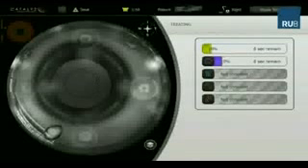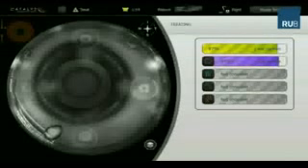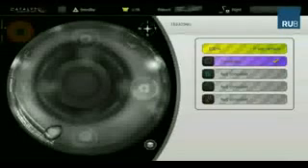A lateral movement of the capsule reflects the high elasticity of the pediatric capsule. We implement a correction factor depending on the age to achieve an optimal capsulotomy diameter.